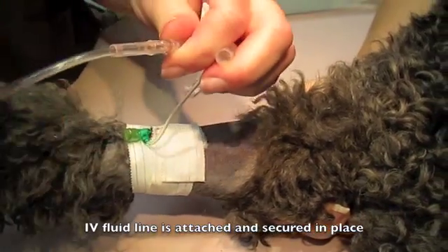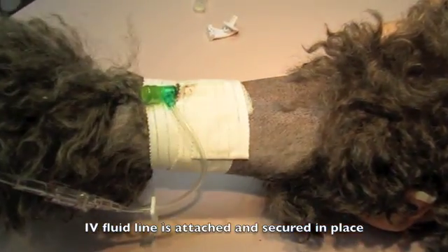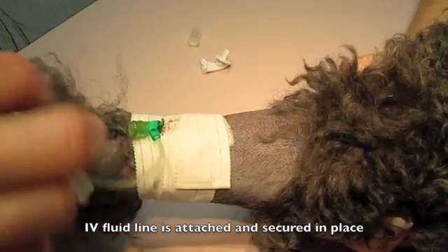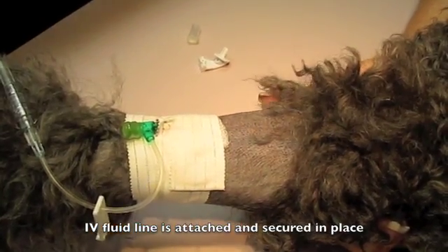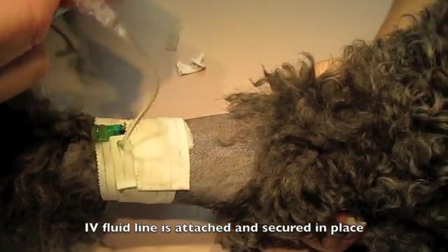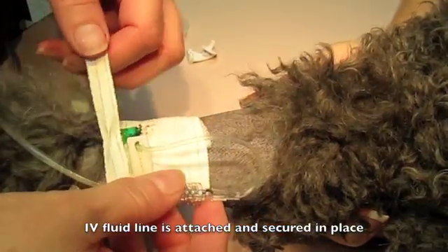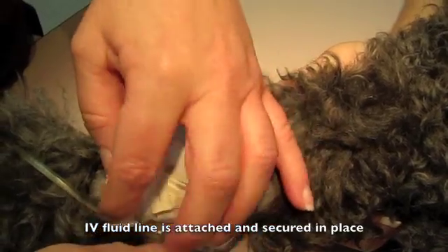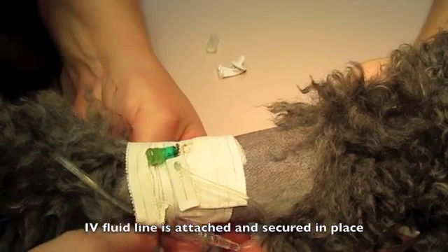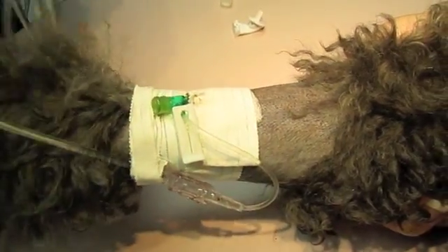Here the technician is attaching the IV fluid line to the IV catheter and T-port. She is now going to use a piece of tape, make a loop in the IV line, and secure that IV line to the pet's leg. That loop is used in the event the pet jerks and pulls on the IV line — it prevents the catheter from being pulled out. It may loosen the loop a little bit, but the catheter stays in place. So there you go — that's how you place an IV catheter.